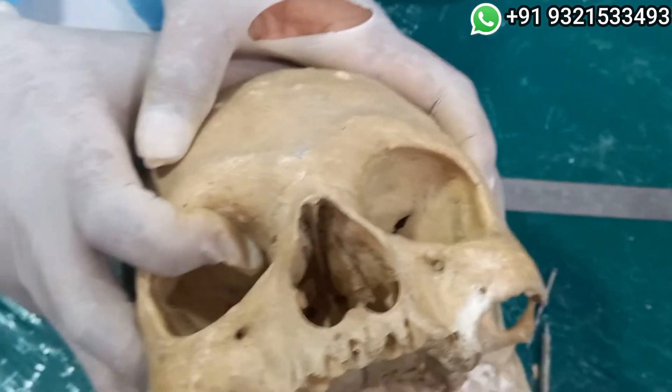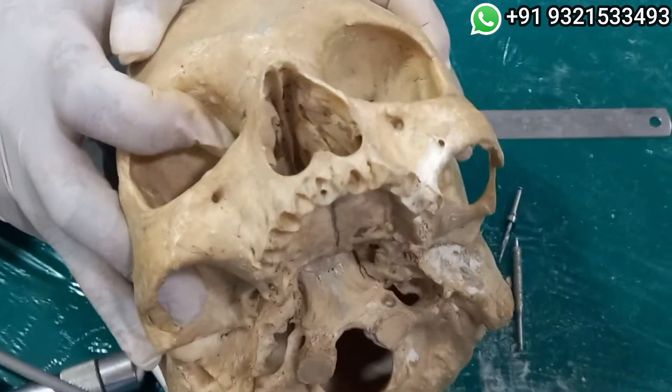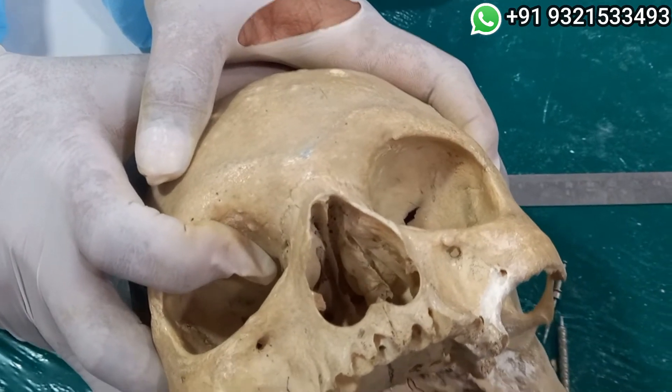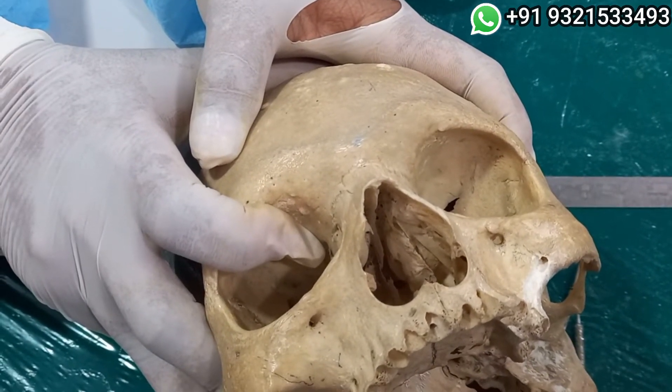The handpiece got heated up — this is a very dense situation. And we are not irrigating. I will just see, otherwise I will have to stop at this point.